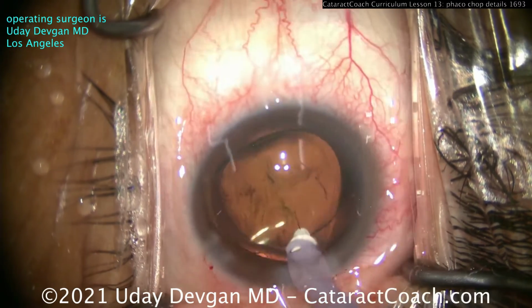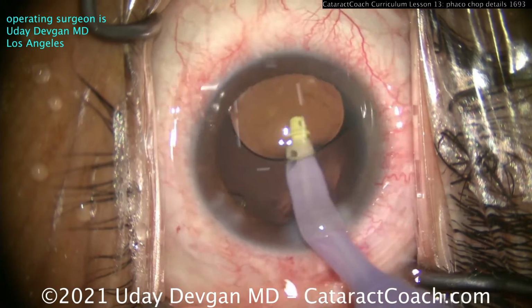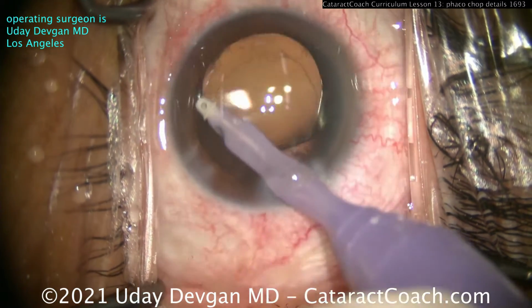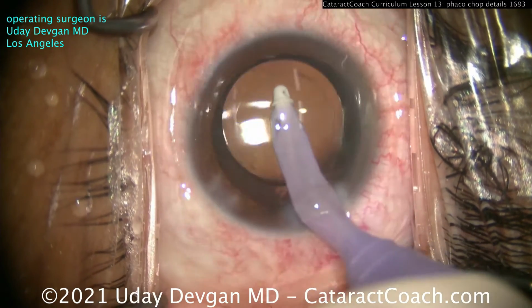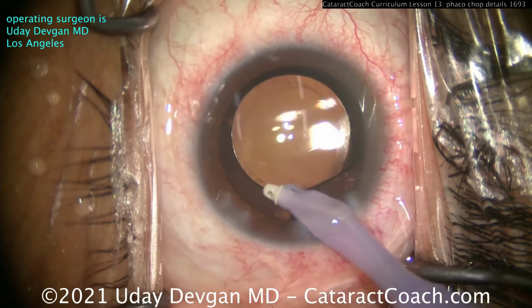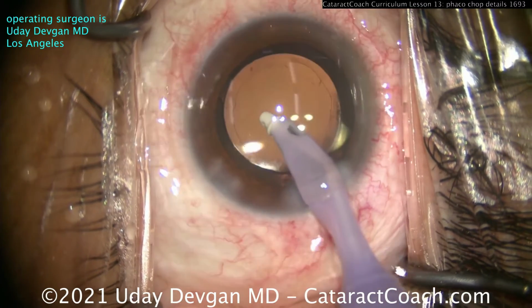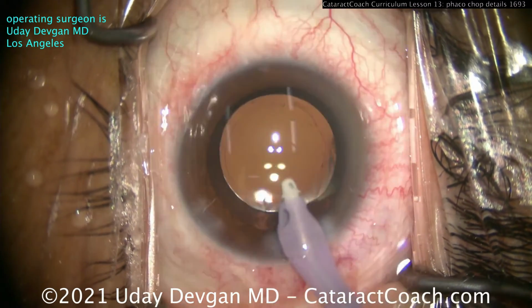So again, what's the take-home point here? You have a mushy cataract, a soft cataract. If you can't get it out of the capsular bag, you're going to have a hard time breaking it in half or chopping it in the capsular bag. Divide and conquer is not great for a very soft lens. So what you want to do is the technique that was shown here, review it if you need to, and that is using higher vacuum without phaco energy to hold on to the lens material and bring it centrally and hopefully bring it outside of the capsular bag up to the iris plane where you can very easily emulsify it.